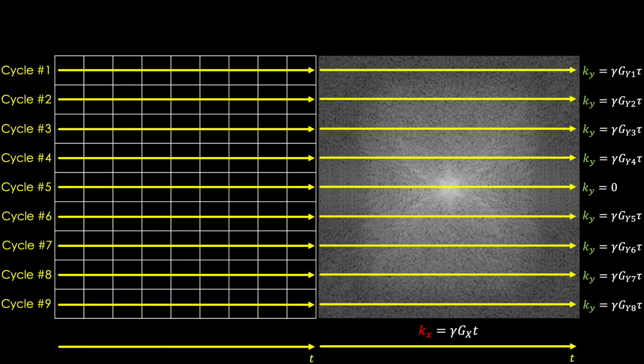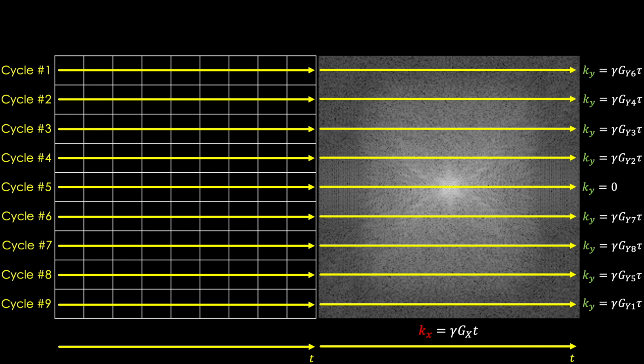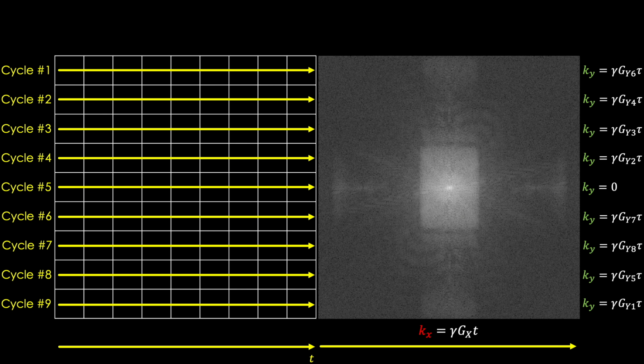What actually happens is if we change the kx and ky values in weird ways by playing with the gradients during the cycle, our picture from this data will change to reflect those, such as this visual of k-space data from a HASTE sequence. Notice how much more radical the picture looks because we did crazy things with the gradients during the pulse sequence, and our echo reflects that.